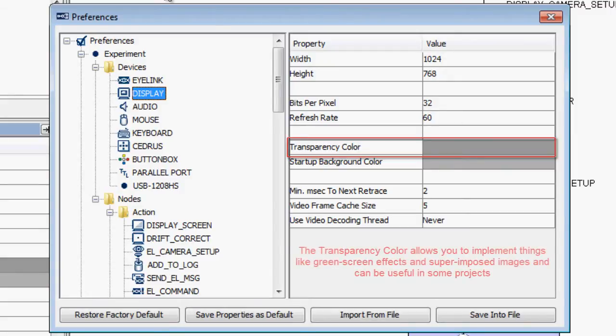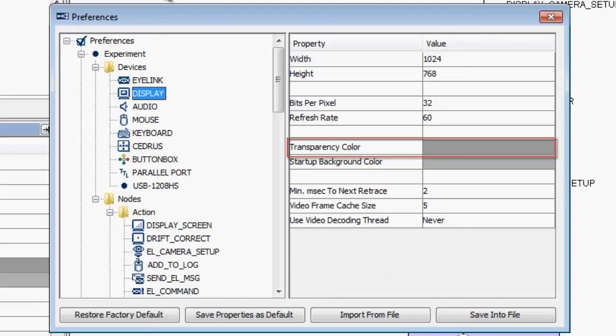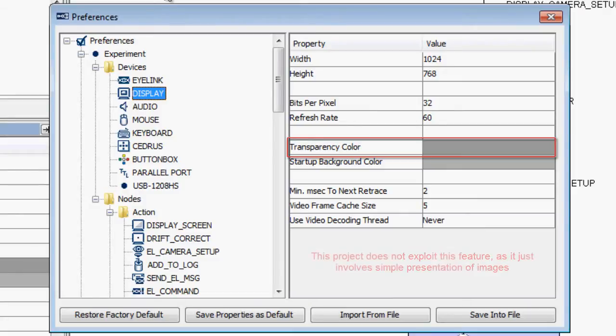This feature can be used to do things like green screen effects and superimposed images, and it allows for some quite useful effects in some projects. This project does not exploit this feature as it just involves simple presentation of images.